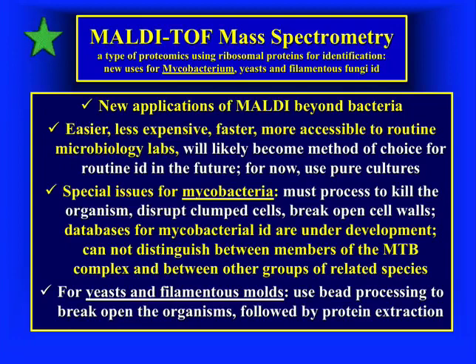So the MALDI certainly is easier, less expensive, faster, and more accessible to routine microlabs than some of the older biochemical methods. And it's likely to become the method of choice, for sure.